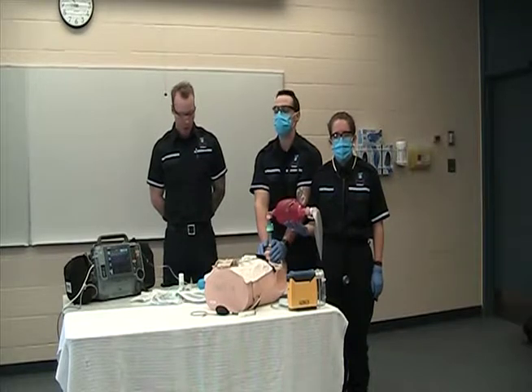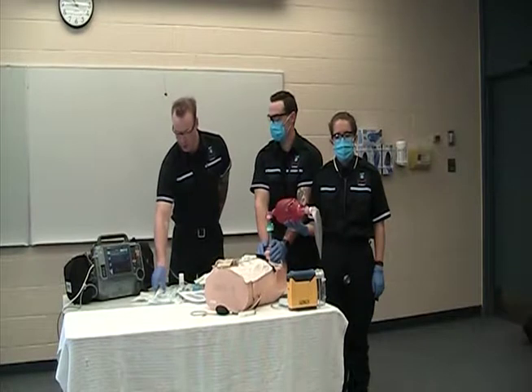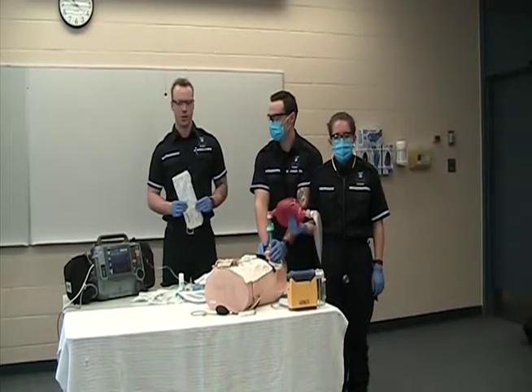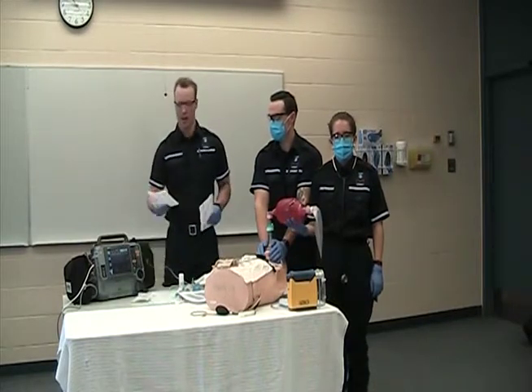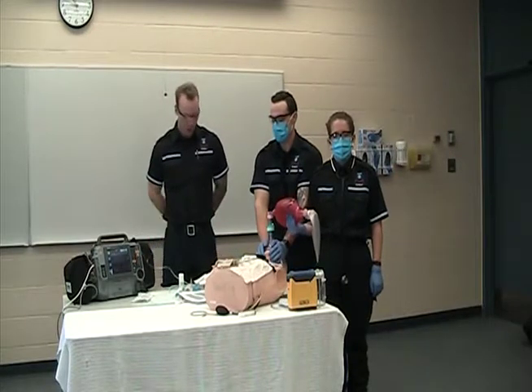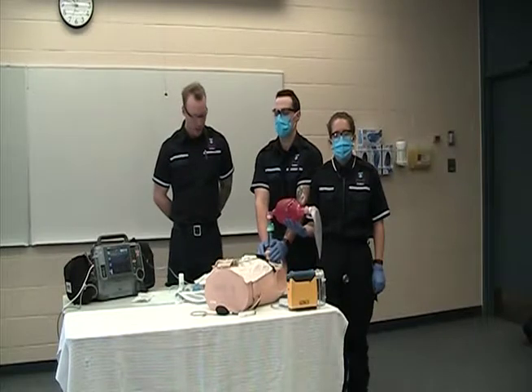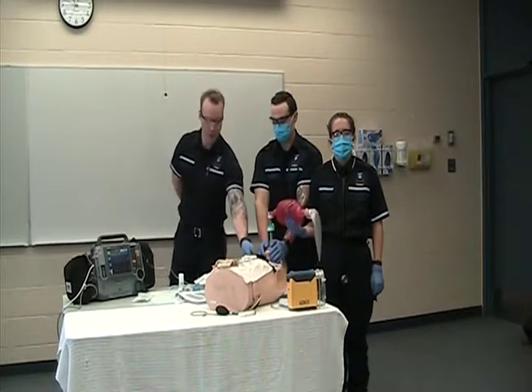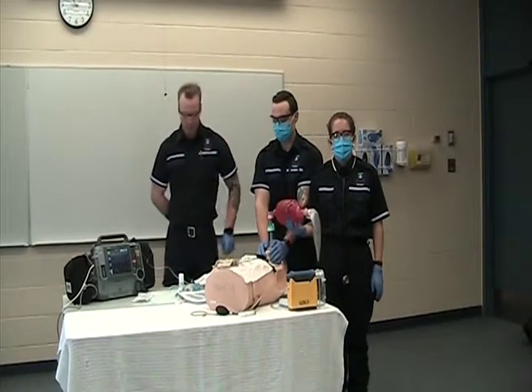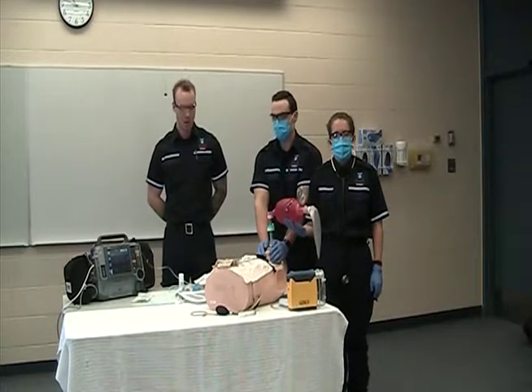We want to make sure we have our laryngoscope and our blade. So with this patient, we're going to use a 7, and we're going to use a size smaller, so a 6.5, and a size bigger, just in case. But on this patient, we're going to be using a 7. We want to make sure we have our OPA, which is already in place, our stylet, which is going to be preloaded onto the ETT tube, which is going to be set onto the patient's chest. We want to make sure we have our syringe, which is also attached to the ETT.